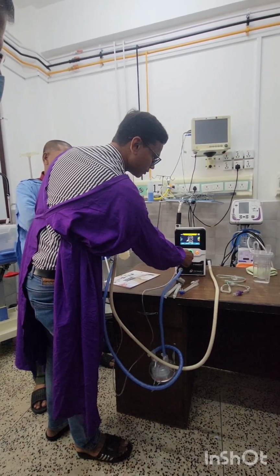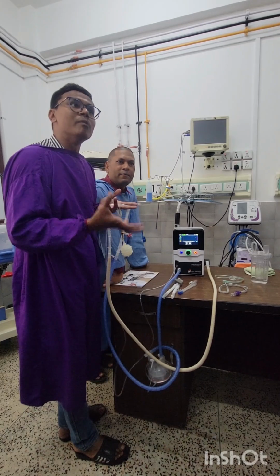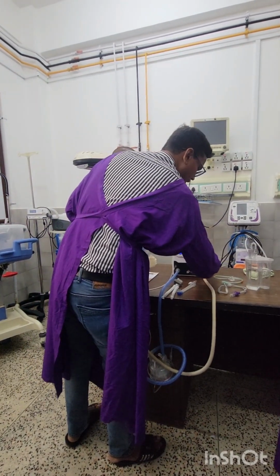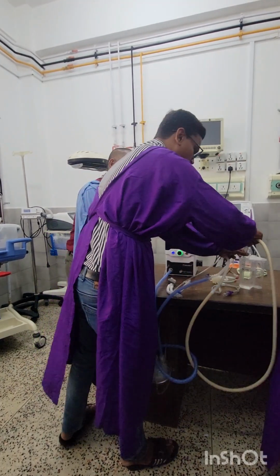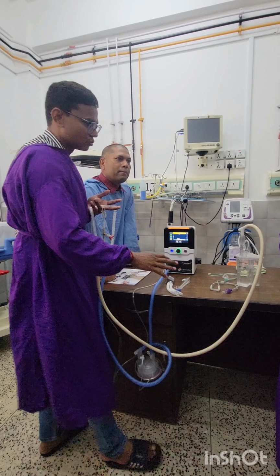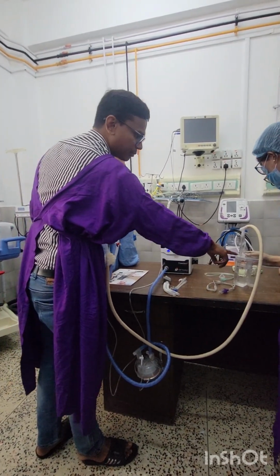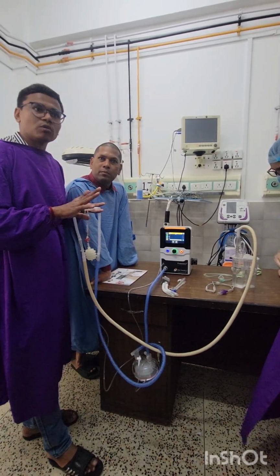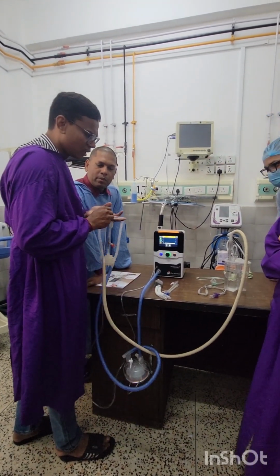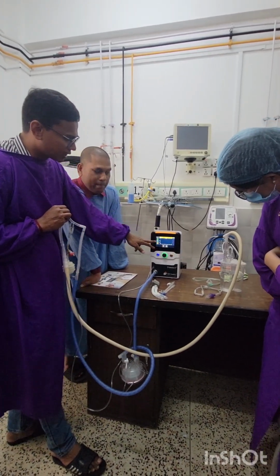So the bubble CPAP, I am starting the therapy. As you know, this is a bubble CPAP, so we require a bubble jar to deliver the CPAP pressure. So here is the bubble jar. We can take out this expiratory limb and keep the expiratory limb here, and we make the pressure like this. So right now we have set the flow, we have set the FiO2, and we have set the pressure at 5 cm H2O here. So 5 cm H2O pressure is being delivered to the baby, as you can see here. Whatever flow and FiO2 you have set, it is delivering to the baby.